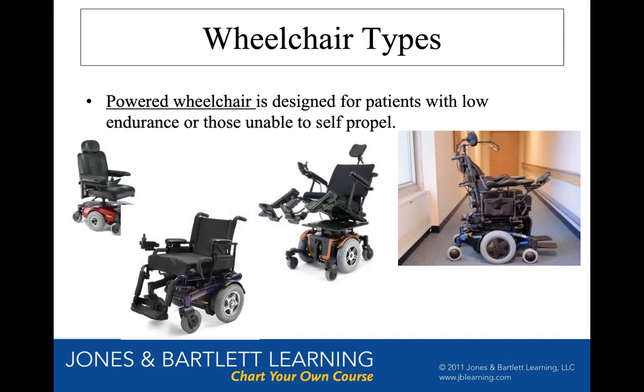Wasn't Stephen Hawking in one of those chairs? Was he? I think he was in sip and puff. Yes, toward the end he was. Now he did have minor use of one hand. He had a lot of spasticity in his hand and tone and involuntary movements, but he could still do some minor movements, and he kept a joystick for a while, but after he lost that, he went to a sip and puff. Yeah, I'm pretty sure.